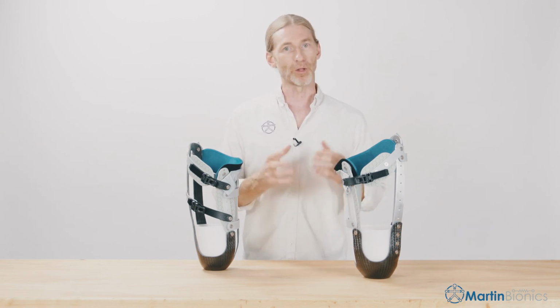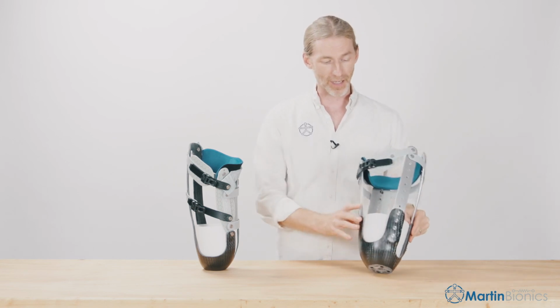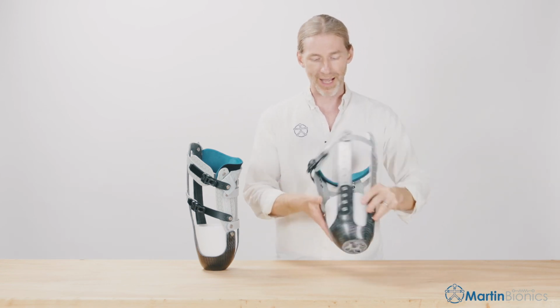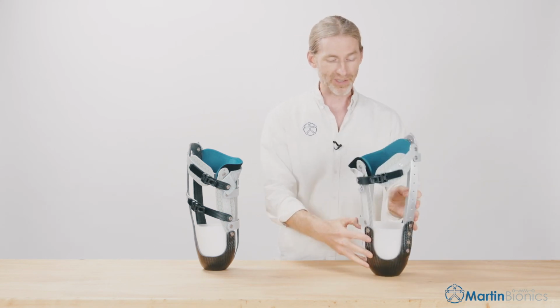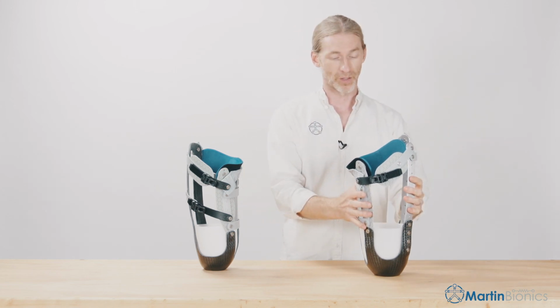This is the new CX Hybrid in its definitive form. So we've taken our initial check socket, our cast version, we've put in the transfer jig, transferred it out to the final stage. There's two paths we can take. One is we can leave the aluminum struts from our check socket stage in the definitive socket, simply making a really short lamination piece that is just the bottom few inches. We have kind of 4 legs to that, where we're attaching our medial panel onto 2 of them and our lateral struts onto the other 2. So this is a really simple way of doing the final fabrication. The whole socketless socket cage just lifts off the check socket and bolts right on, or attaches right on to the laminated version.